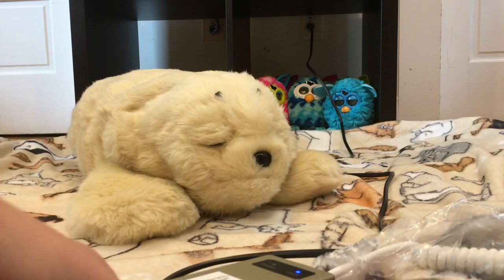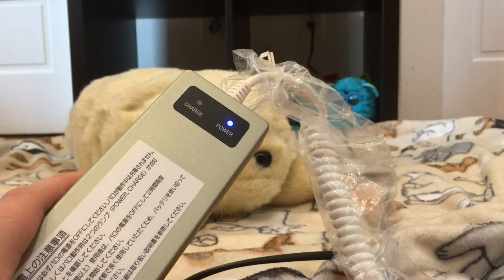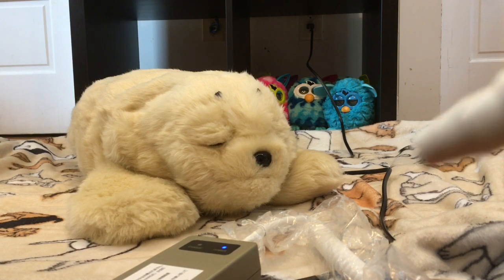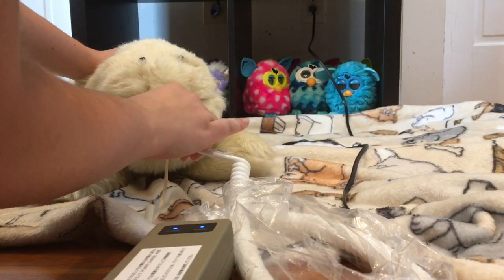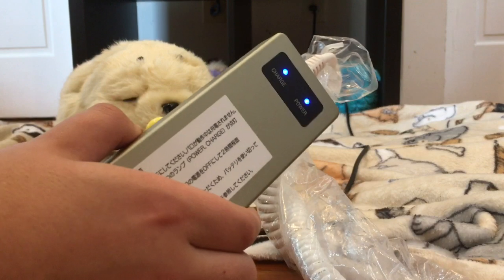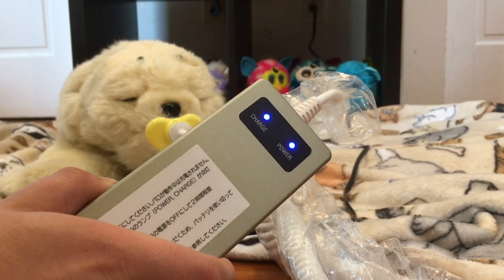So, without further ado, you can see the light here means that the charger is getting power right now. To start charging the PARO, all I have to do is plug this pacifier into its mouth. Once the second blue light comes on on the charger, that means that the PARO is now plugged in and charging.